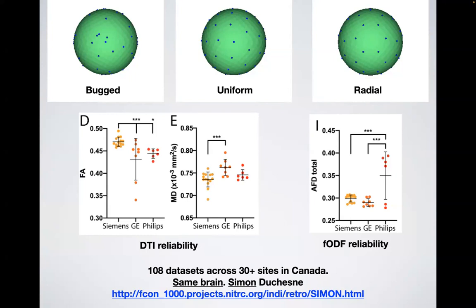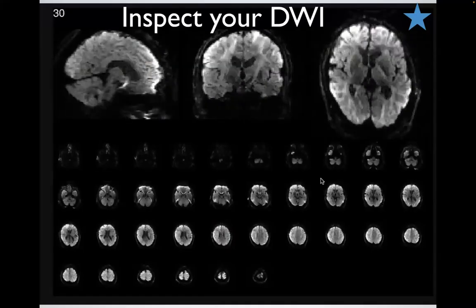So I would say to students now, DTI and diffusion MRI is still quite noisy and unreliable. So be careful. We're becoming better and better, but first thing to do is watch your images and look at the gradient schemes to check if at least the directions where the diffusion was measured are the same.